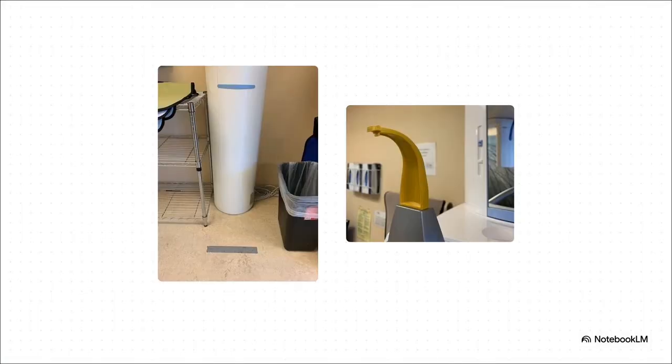And these pictures show a couple of those key steps perfectly. That line on the floor makes sure you're standing at just the right distance. And that little bite stick is what puts your teeth right into what's called the focal trough. That's the zone where the image is going to be the sharpest. Every little detail here really matters.